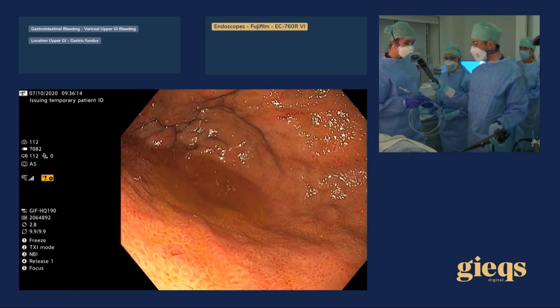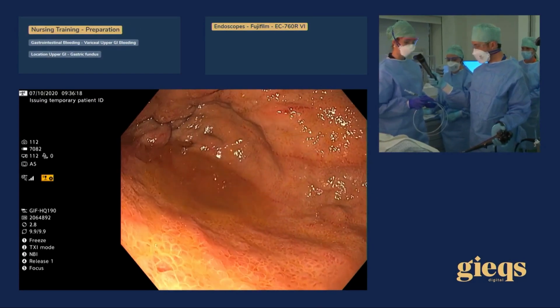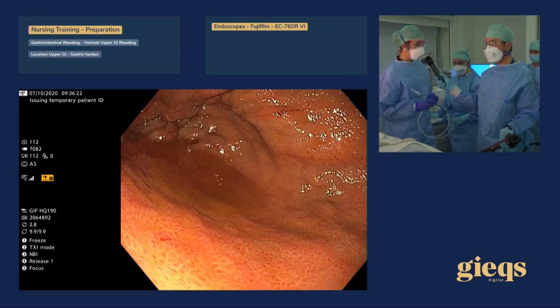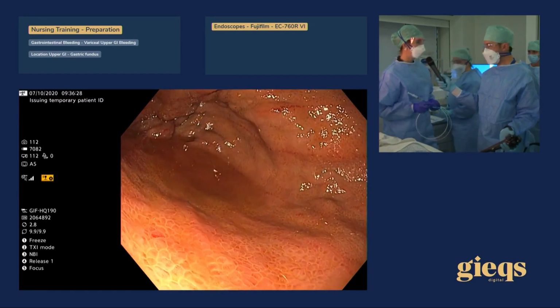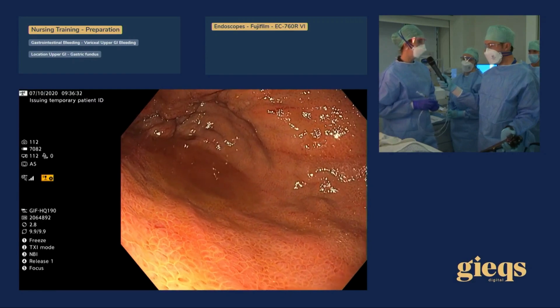Now, first we took a needle of 1 millimeter, the biggest one we have in our unit, and we flushed it with lipiodol. Now we enter the scope with this needle, not already with histoacryl. Histoacryl has to be prolonged with the lipiodol right before you enter the varix.